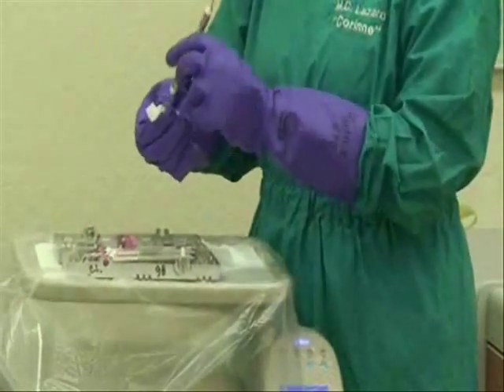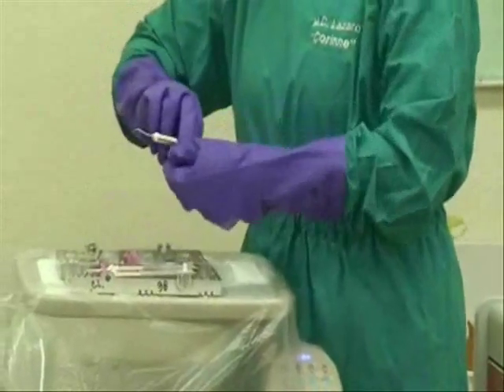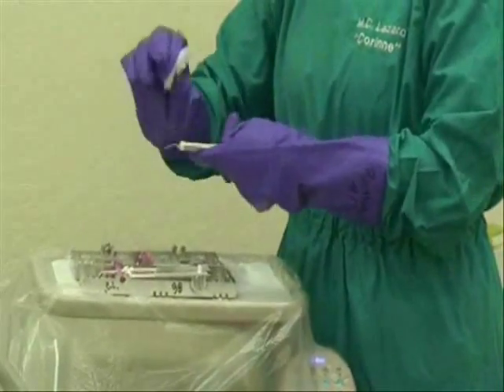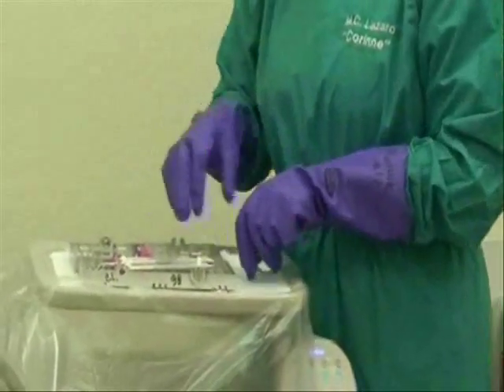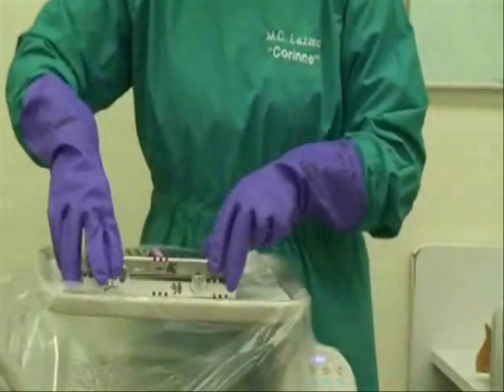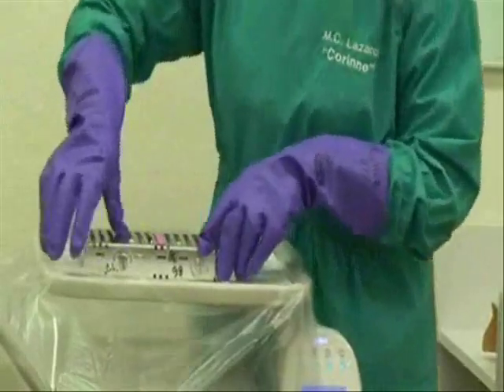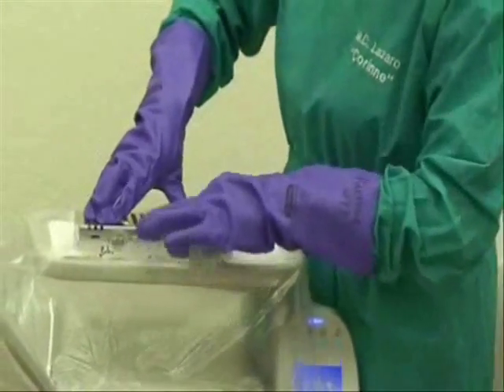All gross debris must be wiped off after patient treatment. Dirty instruments should then be placed in a cassette. Be careful when sorting instruments with sharp pointed ends. Make sure the cassette is completely locked.